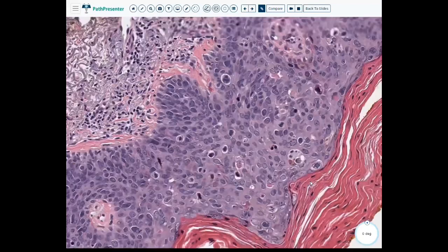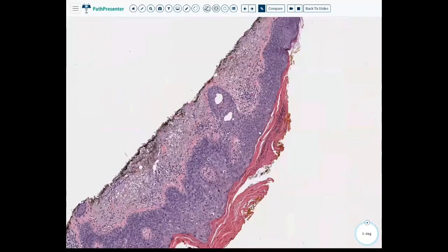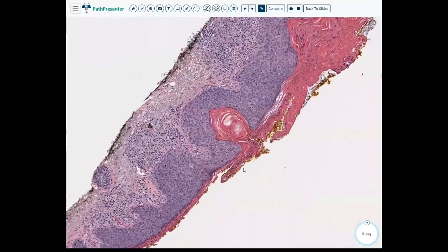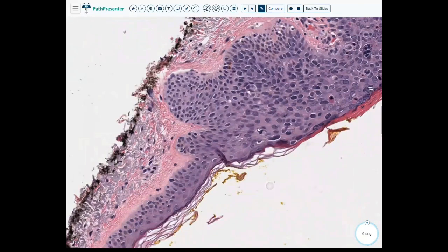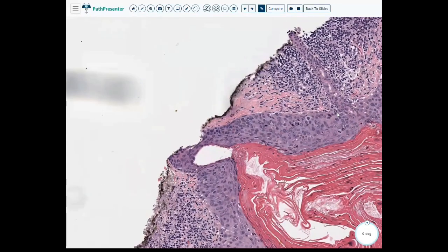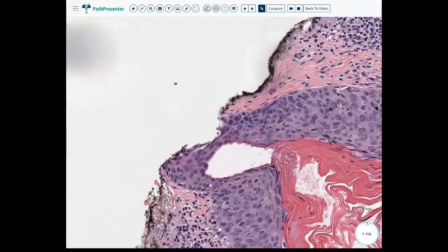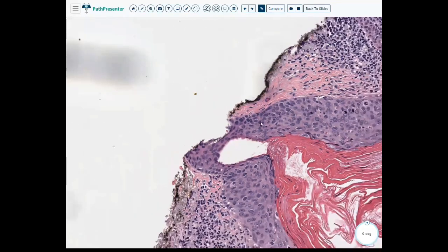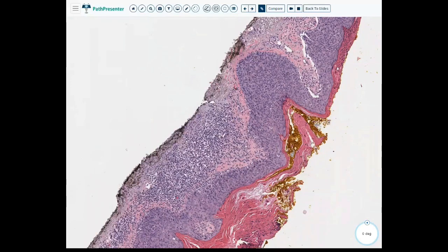We don't worry about the parakeratosis overlying it, even though it's not uncommon to have parakeratosis over top. Often if you have diffuse parakeratosis, let's check what else is going on in the epidermis. We can see it covers the entire area. This is really great because here's the end of the lesion — we have all the atypia and then boom, this is normal epidermis. What we have here — and going quickly to the other piece — same issue we had in the lecture. This is squamous cell carcinoma in situ, also known as Bowen disease.